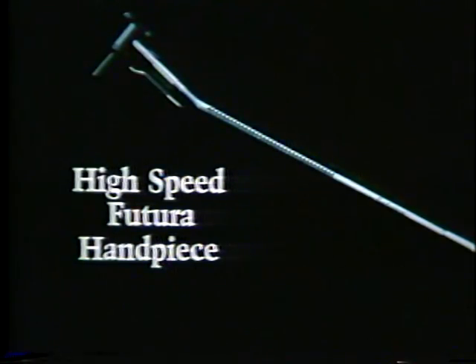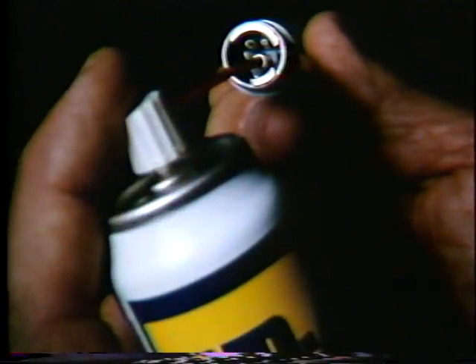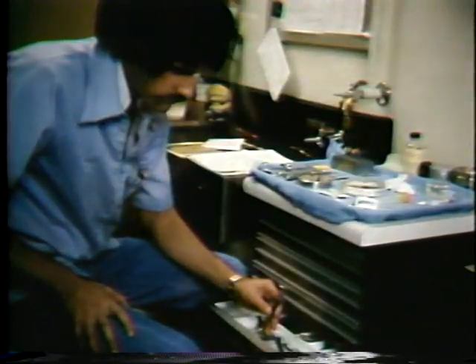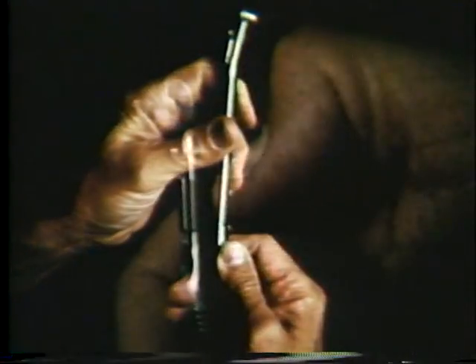Remove the black hose from the handpiece and insert the red tube of the WD-40 can into the largest metal tube at the end of the handpiece. Spray a moderate amount into the hole and leave it until the next use. When you get ready to use the handpiece again, attach the black hose and run the handpiece to blow out any WD-40 that was left.